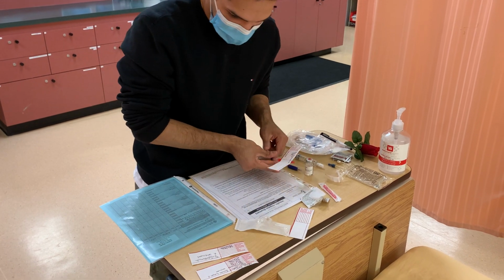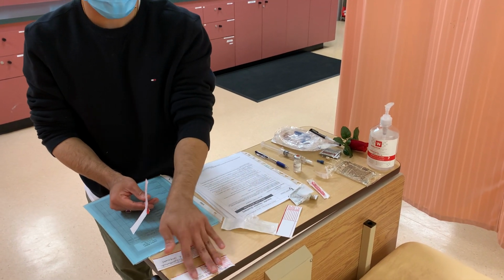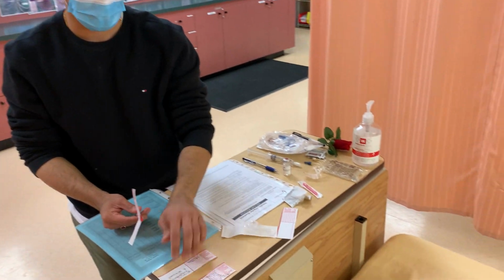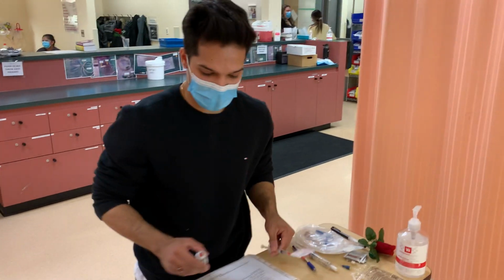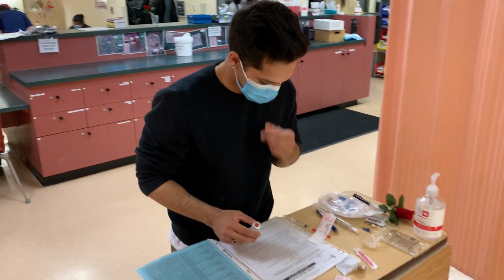Okay, so now that I have everything labeled over here, these are all my other labels I'm going to be using. This is my label for the bag, and this is my label for the line that I'm putting on the line once I start my medication. Okay, so now I'm going to do my second check.